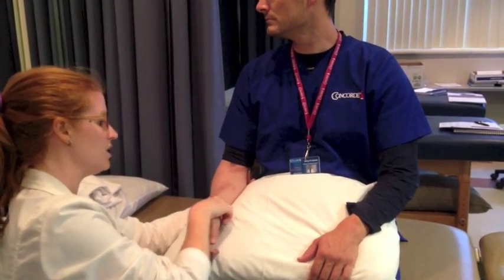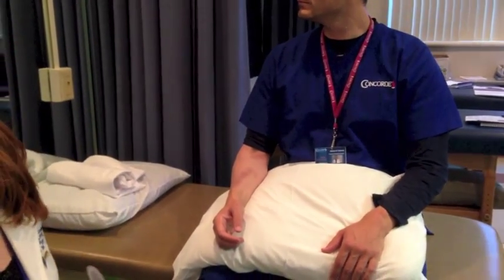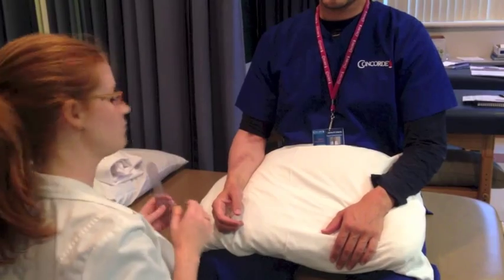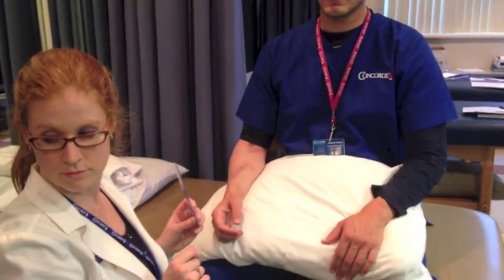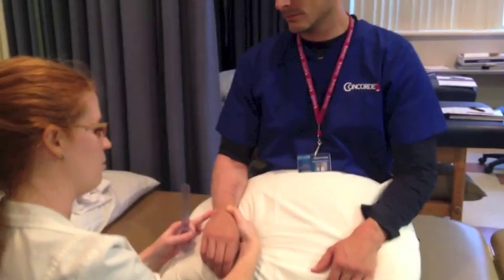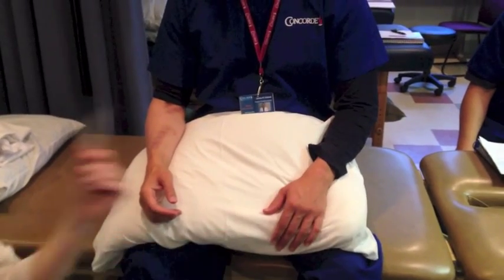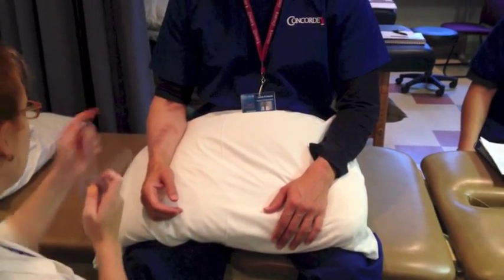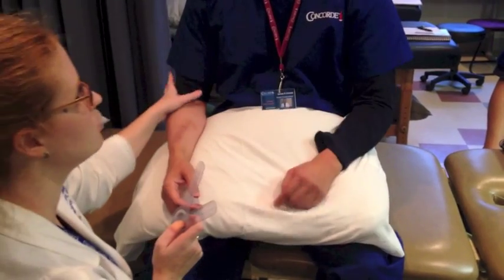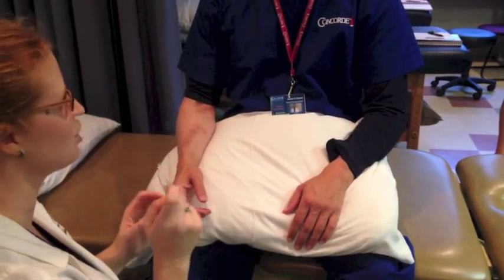I'm going to let him rest in neutral because, likely, if we're taking these measures, one way or the other will be restricted or painful. The first one they're going to do is pronation. Where is our fulcrum? The ulnar styloid — once we come here, this is where we're going to line it up. And where is our stationary arm? Parallel to the anterior midline of the humerus. If their arm is in neutral, point it straight up to the ceiling — that's the easier version of how to do it.